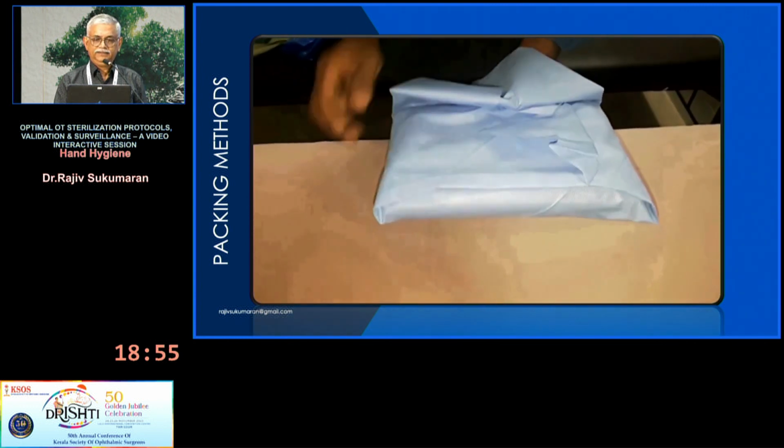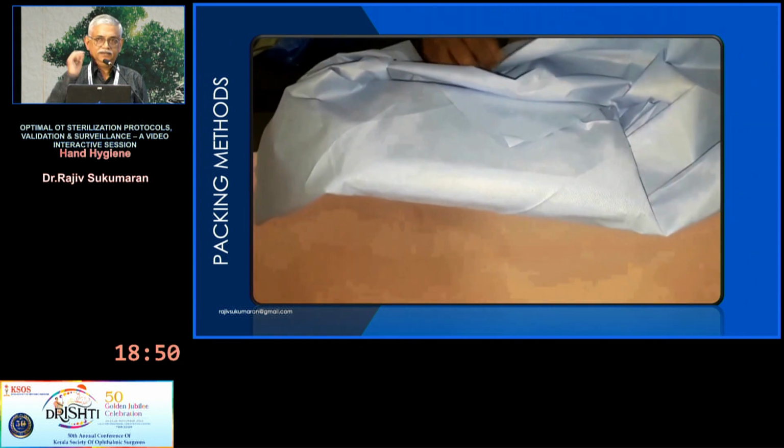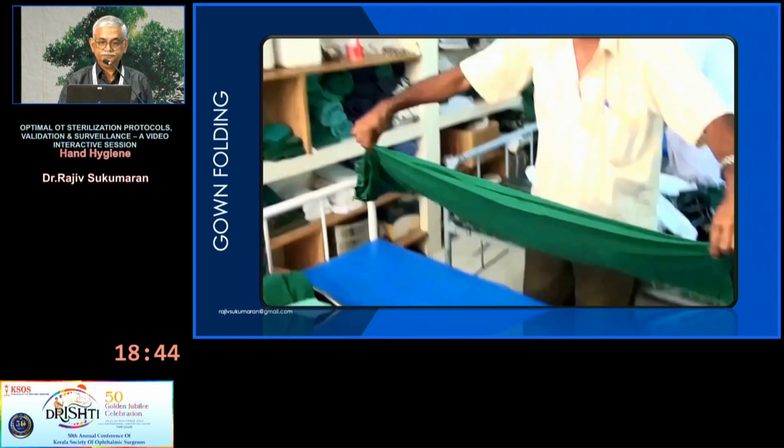So, you open up like that, hold the flap without touching the inner instruments which you are going to hand over, and then you hand over to this. This is called the envelope method.